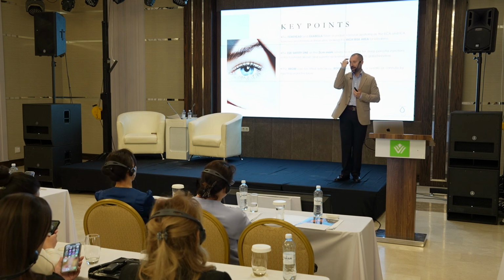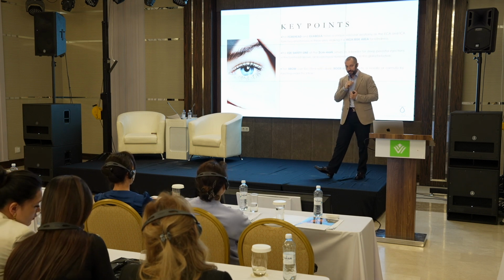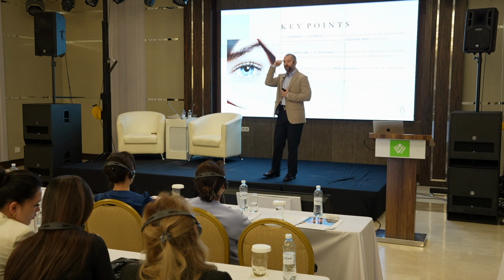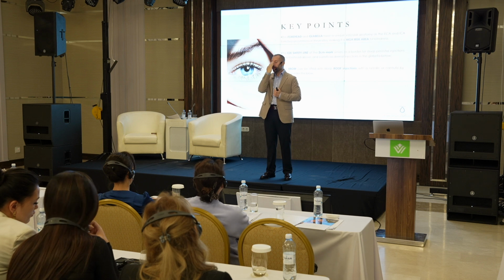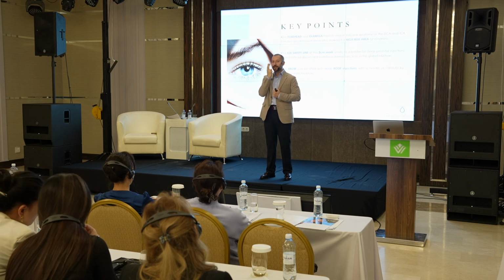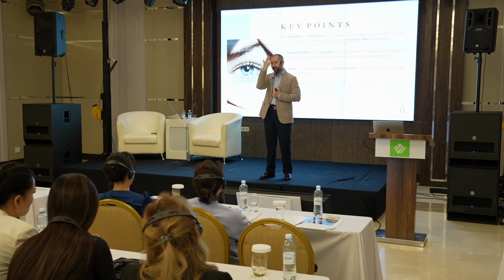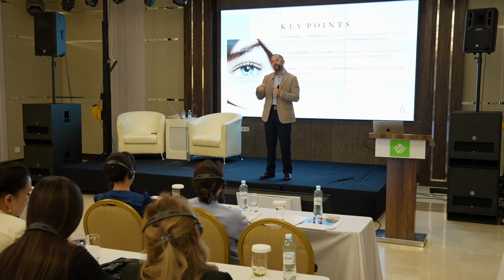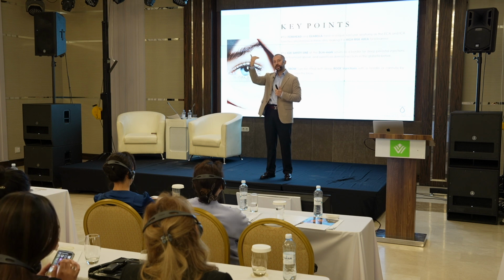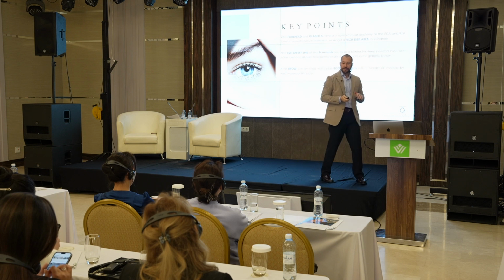Safety line in the forehead, let me remind again, the safety line 2 centimeters above the rim, the arteries below this rim, they come deep. Which arteries? Supraorbitalis and supratrochlearis. After this line, they are coming more superficially. So vice versa, the reverse. If the artery is superficial, we inject deeply, okay? And deep to the galea.